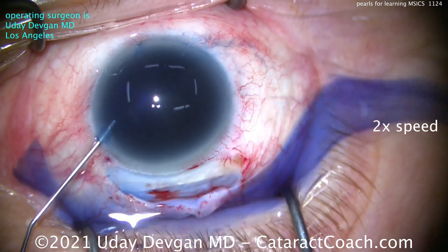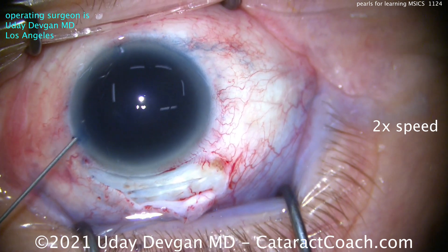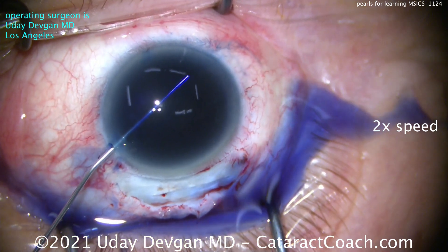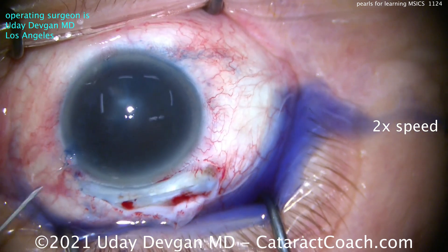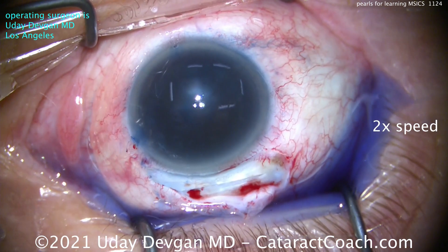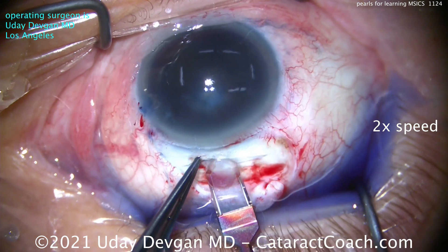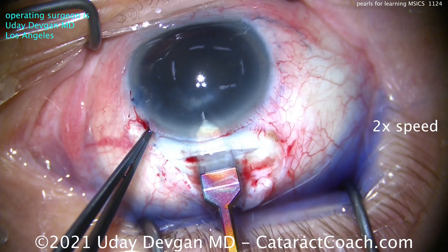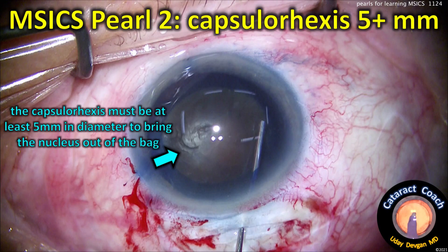We dilute out the trypan blue dye — we left it in there for a long time to get a good stain. Now we put in dispersive viscoelastic, which is very important. You can see there is no red reflex whatsoever. We go in with a diamond keratome, make sure we're in the correct plane, and then make a nice clean entry. We'll leave it as a single 2.75mm incision at this point.